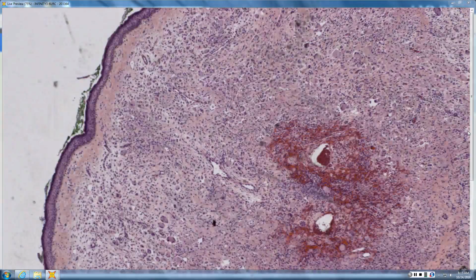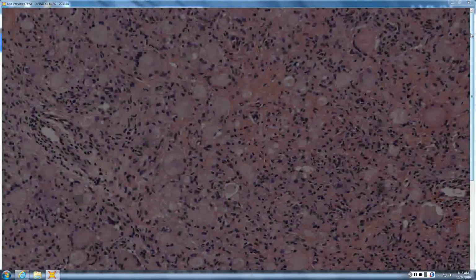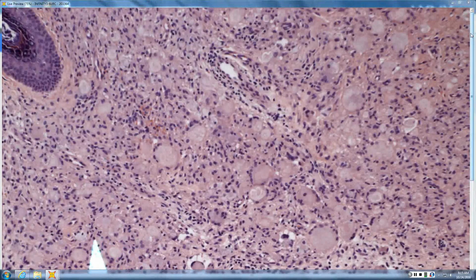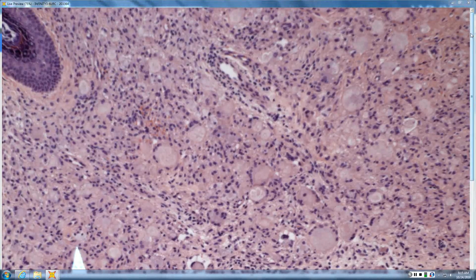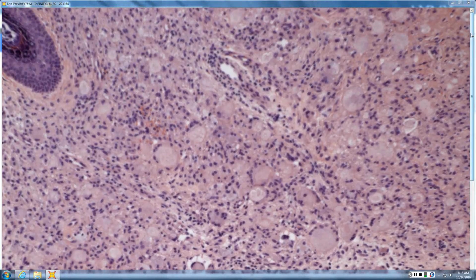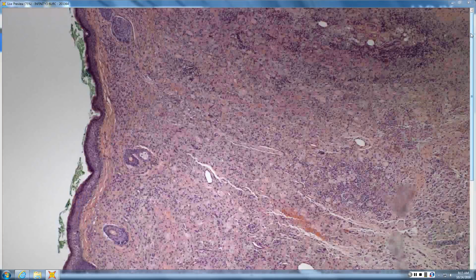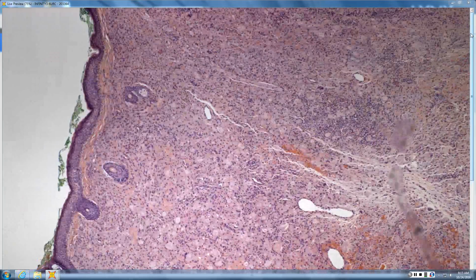Okay, how about this one instead, Iris? Okay, so there are giant cells, granuloma. The giant cells tend to be wreath-like, often with lipid at the periphery of the wreath. So is it a xanthogranuloma? Xanthogranuloma would be the most likely for that.